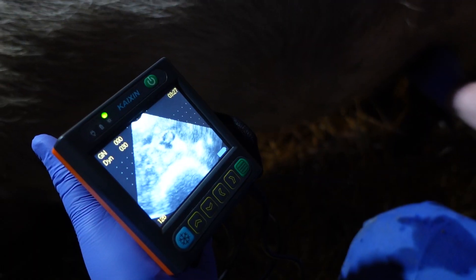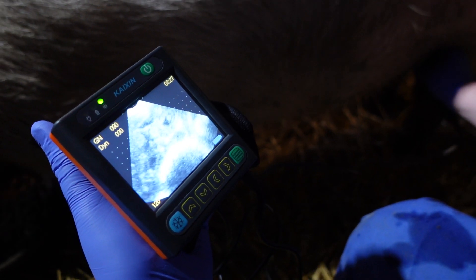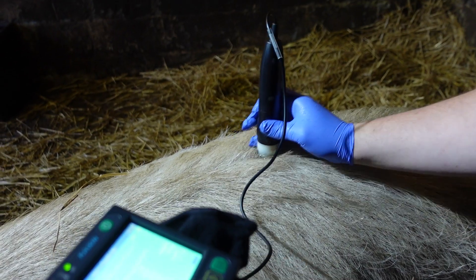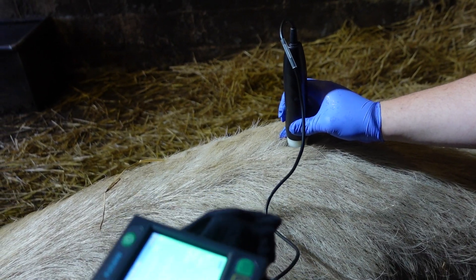As well as clear, easy to identify images, it also operates at just the right frequencies for more tricky animals to scan like pigs. We tested the MSU3 on some pigs in Surrey and again found it very easy to identify the foetuses, and the back fat feature is also a real bonus to pig farmers.